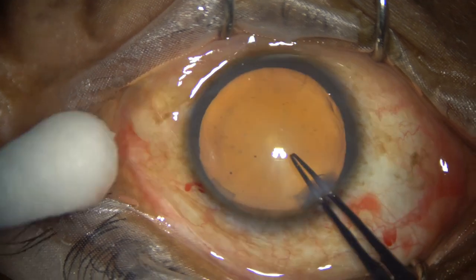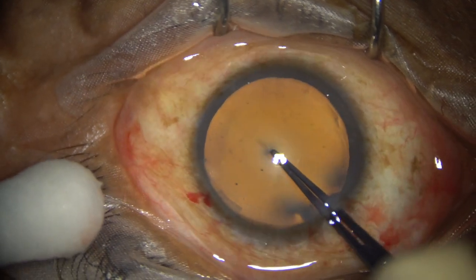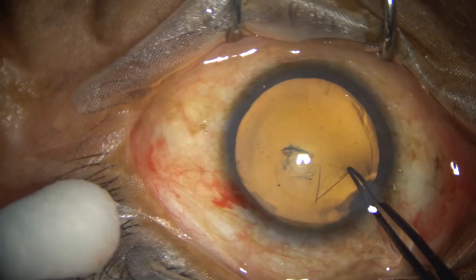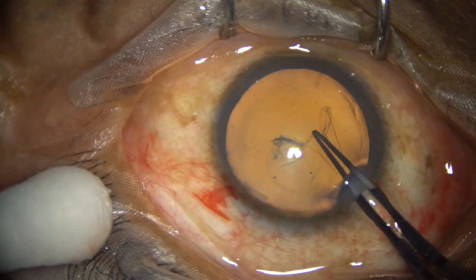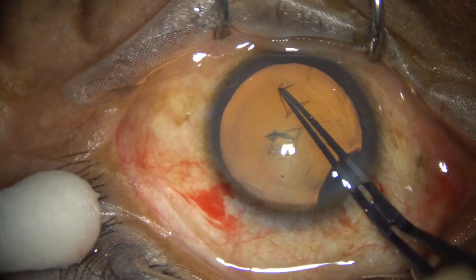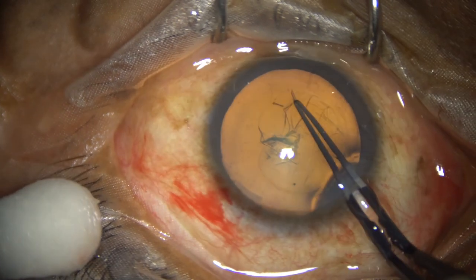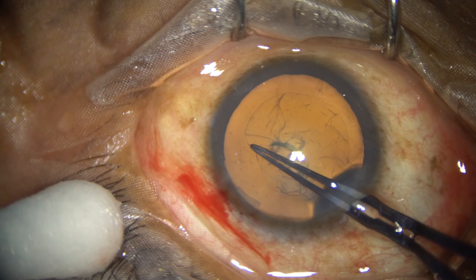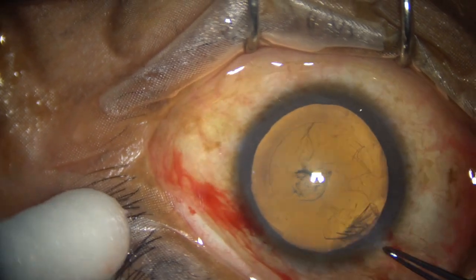Capsulorhexis is done with utrata forceps. The anterior capsule is torn, and a capsular tag is raised by the tip of the utrata. This capsular tag is guided anticlockwise all around to get a fairly round, adequate-size rhexis of about 5.25 mm.